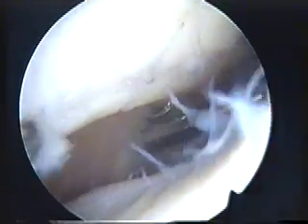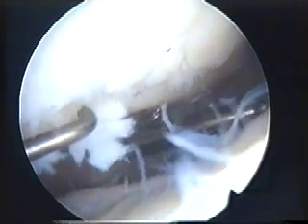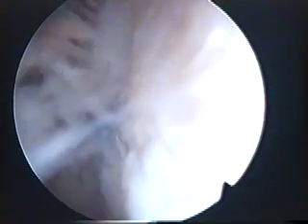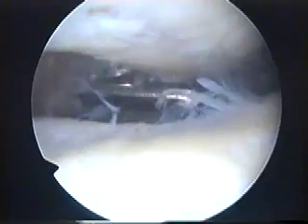Here's the back of the patella, which you can see is extremely loose. There are large flaps that are hanging down, and when the knee is working this produces a crunching sensation. The fat pad over to the left is inflamed, and the patella groove is also very loose with large overhanging flaps.